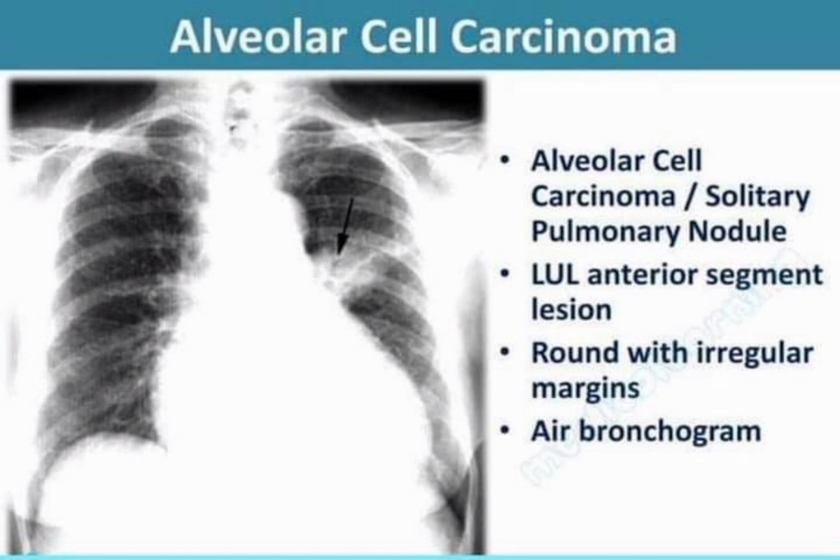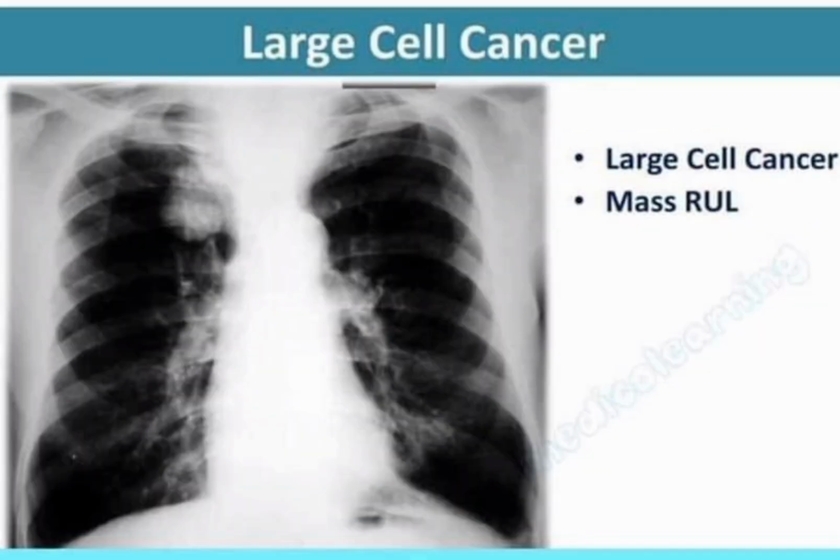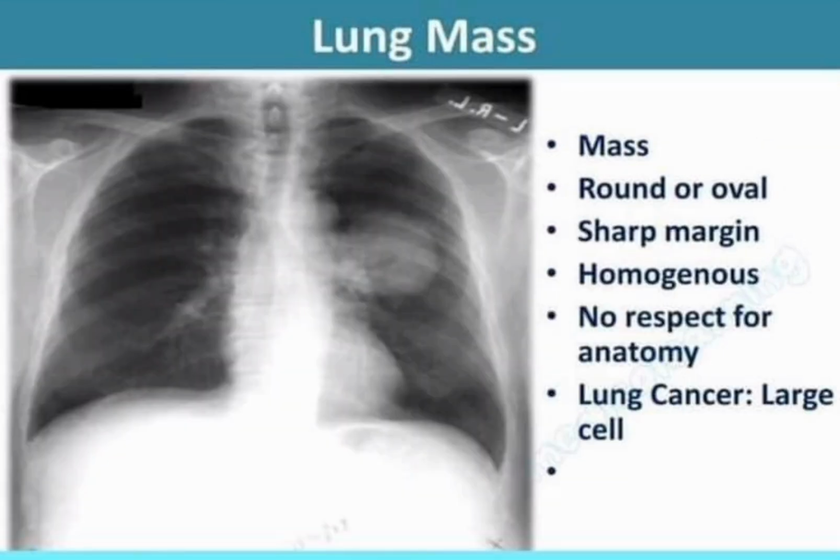Fractures. Rib or spine fractures or other problems with bone may be seen on a chest X-ray. Postoperative changes. Chest X-rays are useful for monitoring your recovery after you've had surgery in your chest, such as on your heart, lungs or esophagus. Your doctor can look at any lines or tubes that were placed during surgery to check for air leaks and areas of fluid or air buildup.